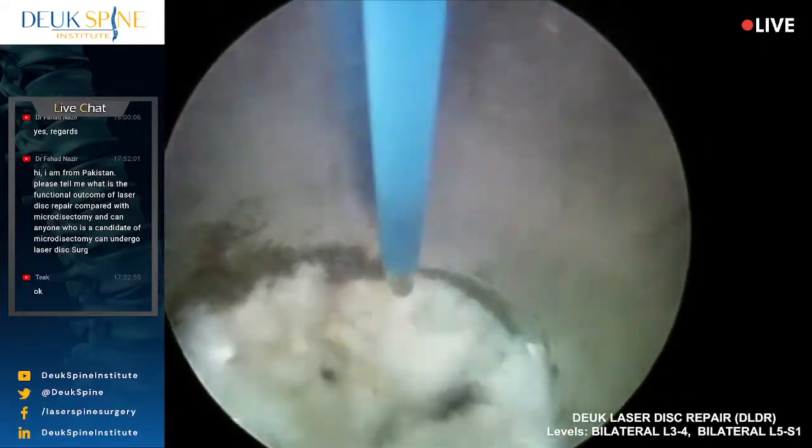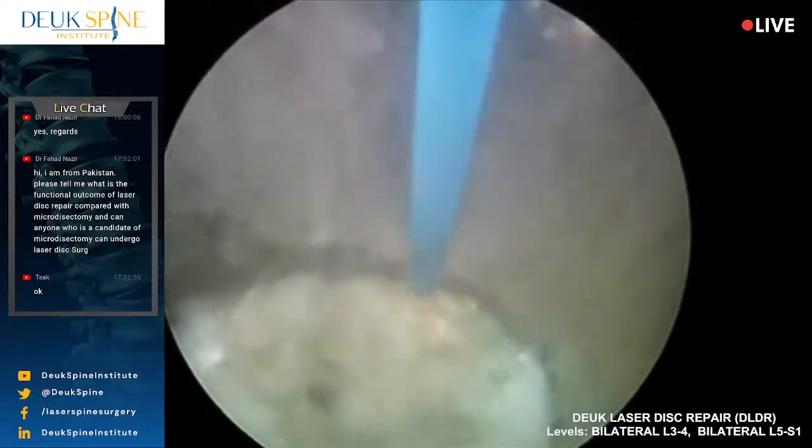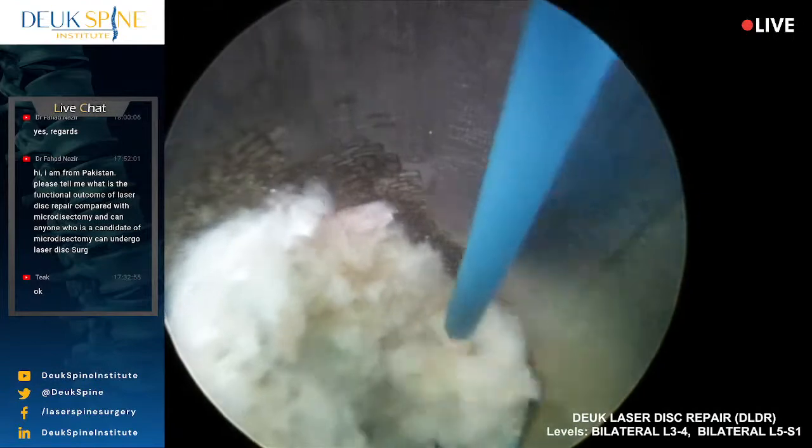Louise, have you ever seen this much? It just doesn't stop.